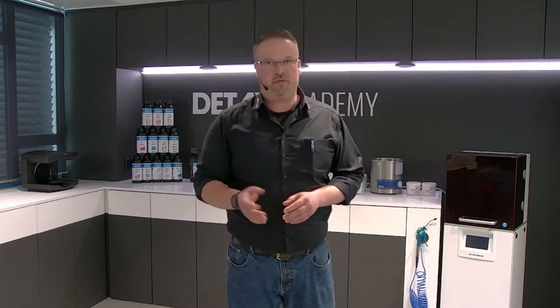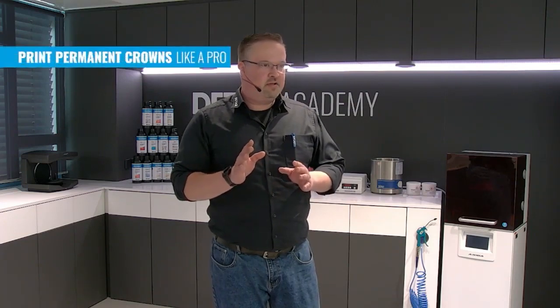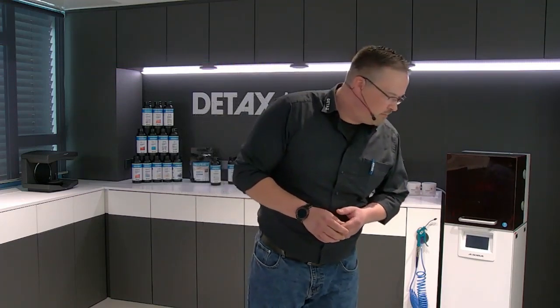And you see, prepare the print job. The modeling takes a little bit more time, but preparing the print job, printing, and also the finish is a really fast process, easy to work with, totally different to all the other materials, you know. So from my point of view, let us go to the live chat now. I saw you write us some more questions. Let me see on the screen.